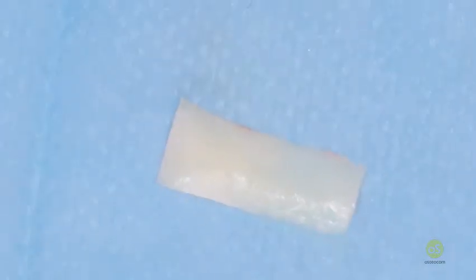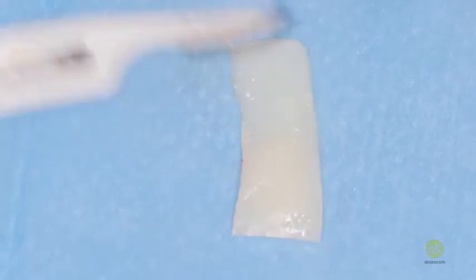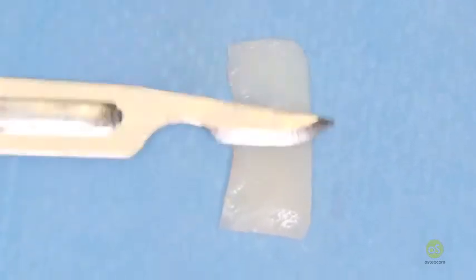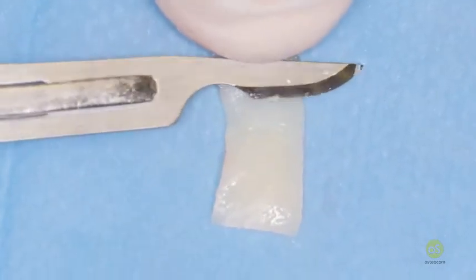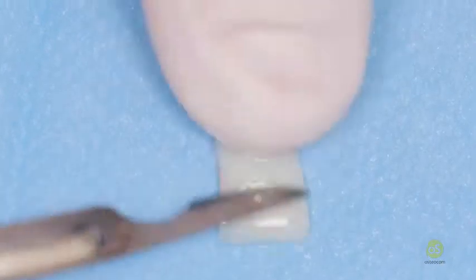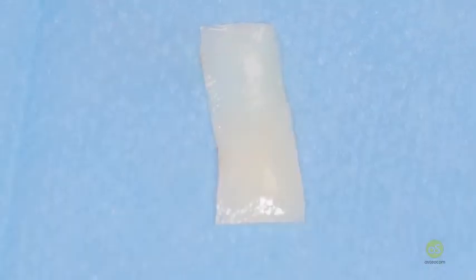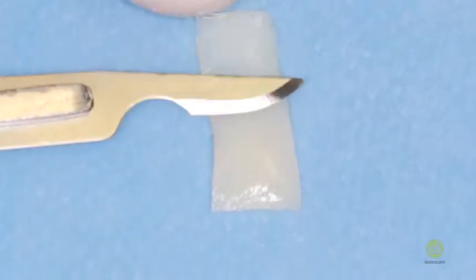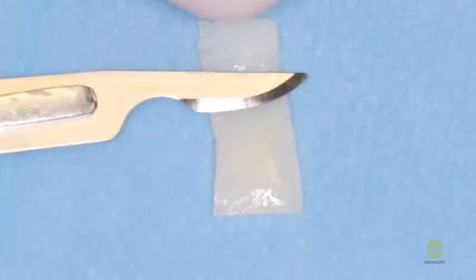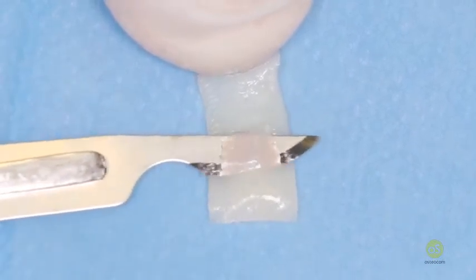Now half of the graft is desepithelialized, you turn it, you place your blade on the already desepithelialized area. Here there's still an area. You should see quite well the difference between connective tissue and epithelium. So you get into the area where there is already desepithelialization, and then you make the desepithelialization of the second half.